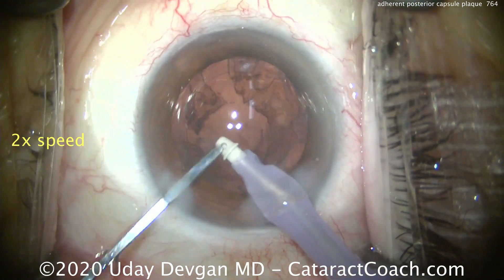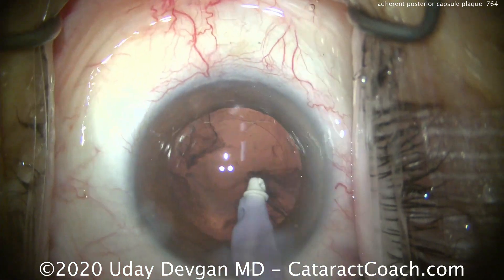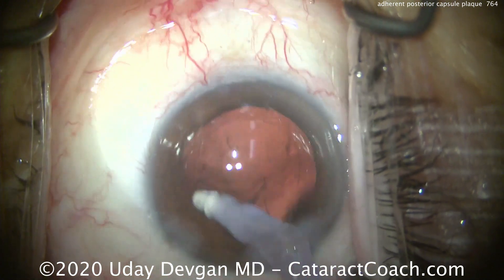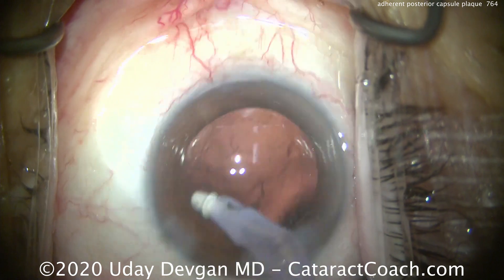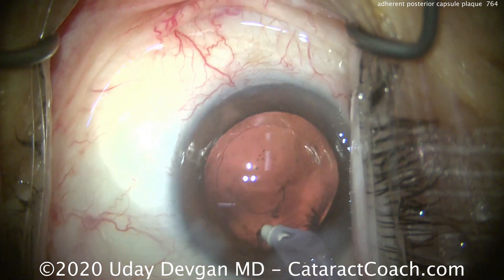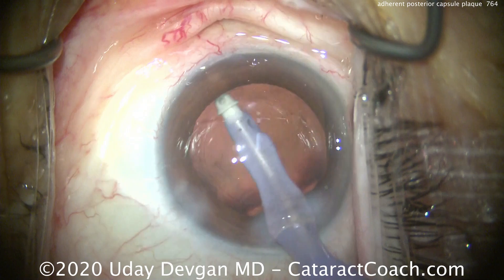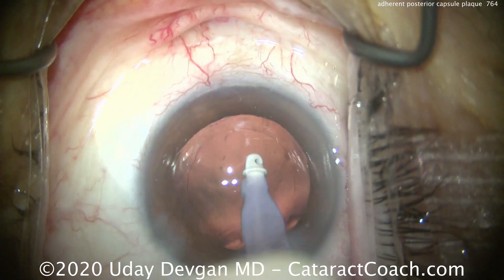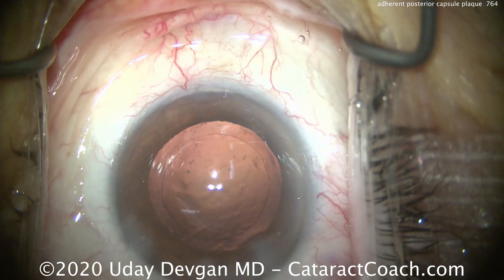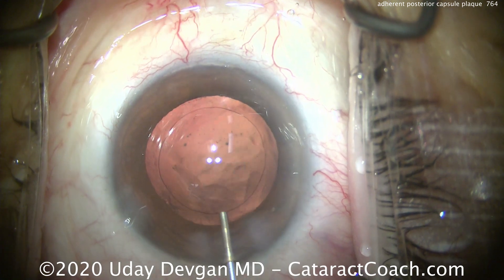Now when we remove the cortex, you'll see there are areas of the capsule that are frankly stained or fibrotic from having that opaque, dense cataract in there for a long time. If you think about it, what is the human lens? It's primarily protein. These proteins get denatured or damaged with time, and we can get some of these denatured or damaged proteins causing this fibrotic-type tissue on that posterior capsule. You see that little bit of a fibrous plaque there — that linear streak.